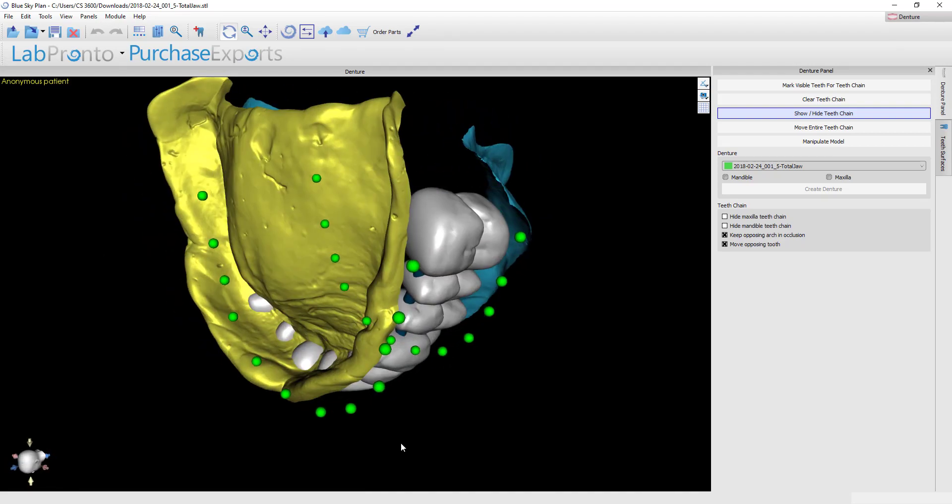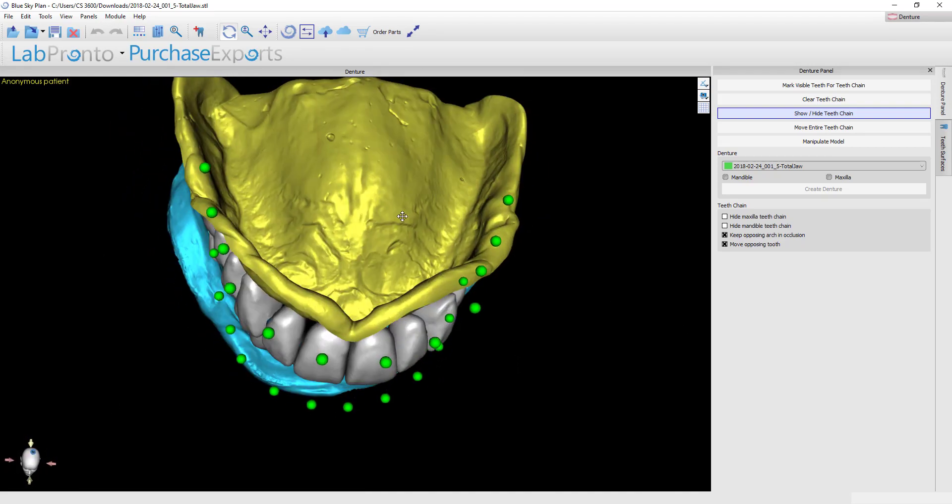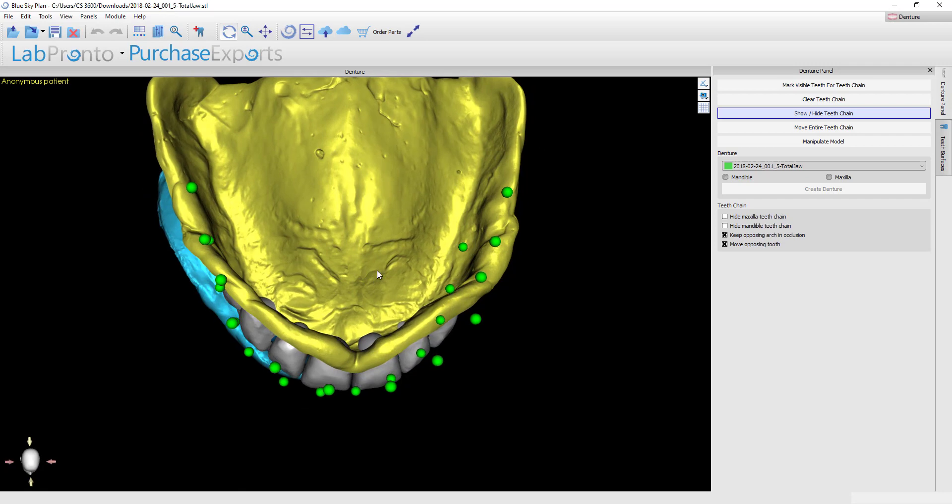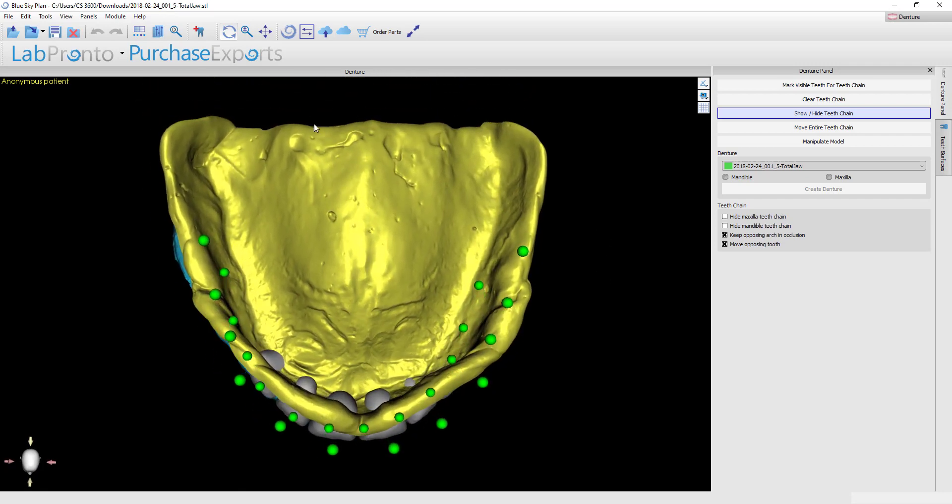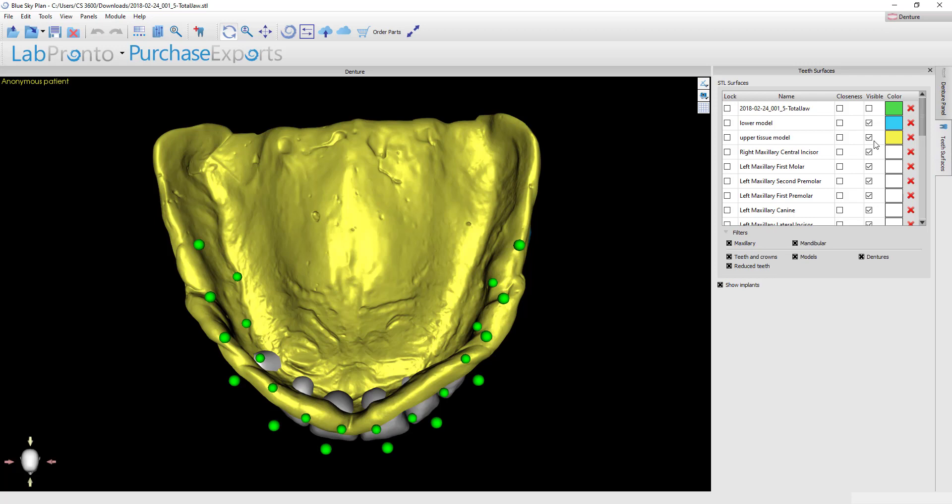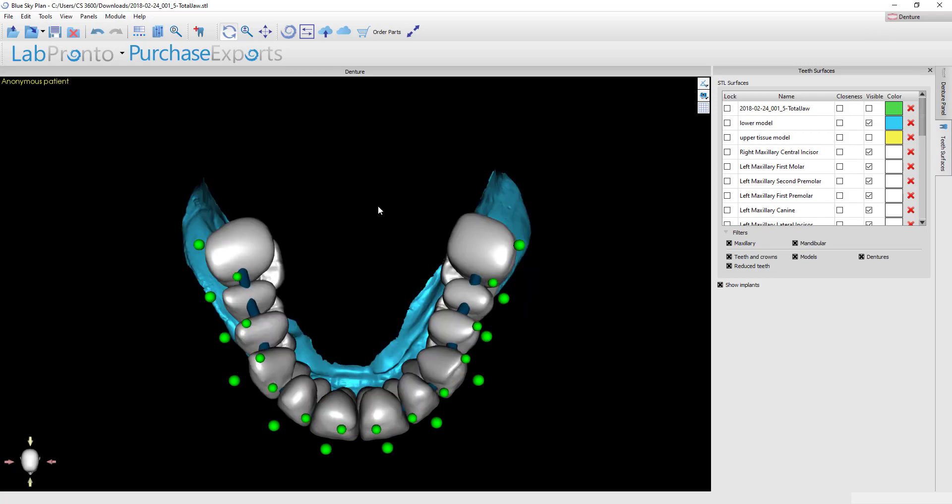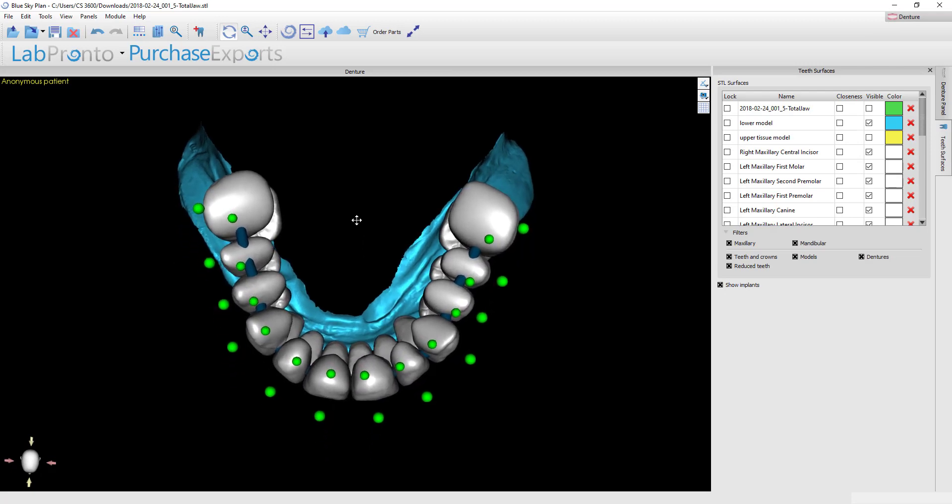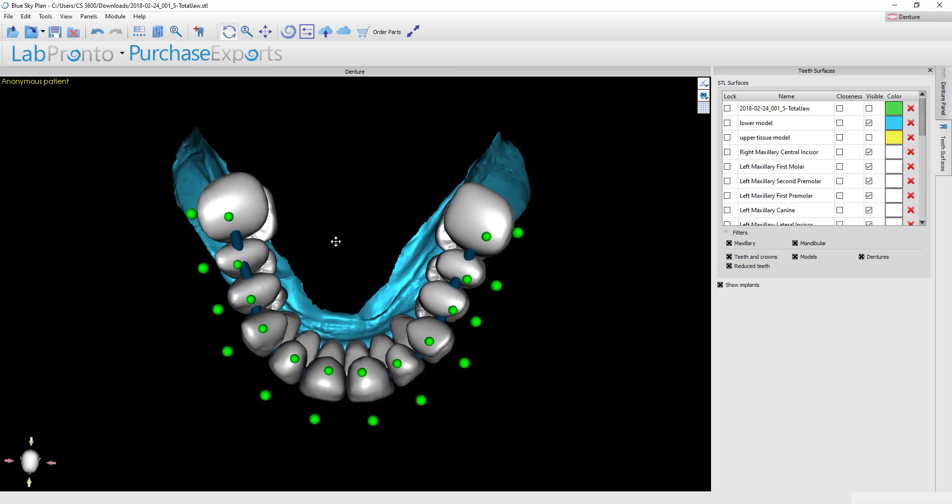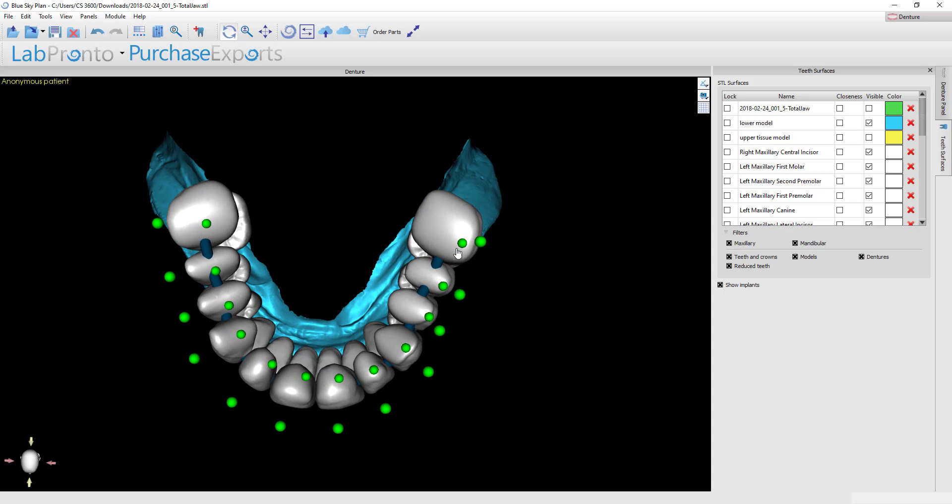I really want to make sure that my teeth are sitting over the top of the mandibular ridge because that's the one that's going to have the most trouble with stability. So what I want to do is hide this model. You can toggle it on or off here or you can right-click this model and hit toggle visibility. Now I can see very clearly when I look from above that the teeth seem to be sitting over the top of the ridge fairly well on this side.